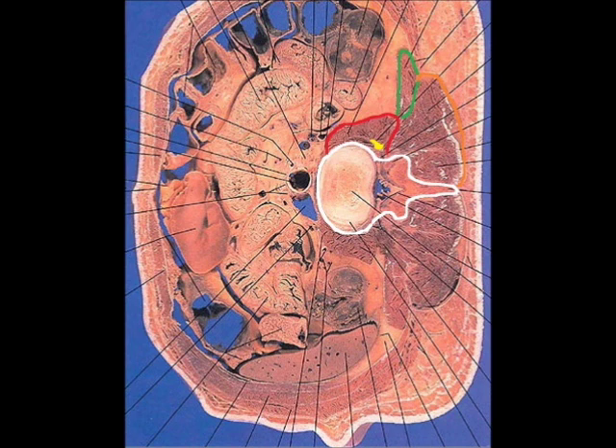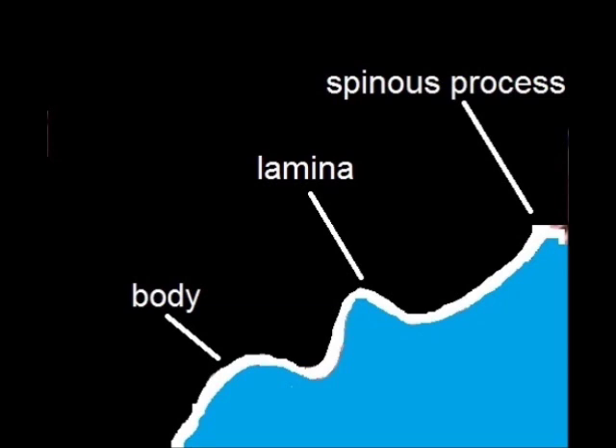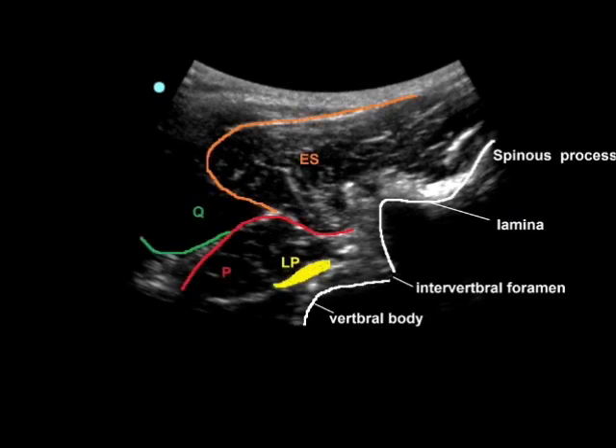Note that the spinous process appears at this level. With the described ultrasound position, the cut will be like this. In this image, if you remove everything except bone, the lateral surface of the spinous process, lamina, and vertebral body will appear like a wave — I call this the wave sign. On the ultrasound image, the wave sign can be identified, and the lumbar plexus can be identified just lateral to the body of the vertebrae.